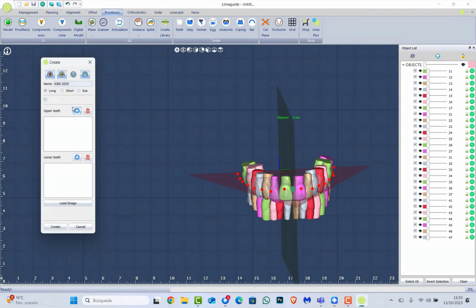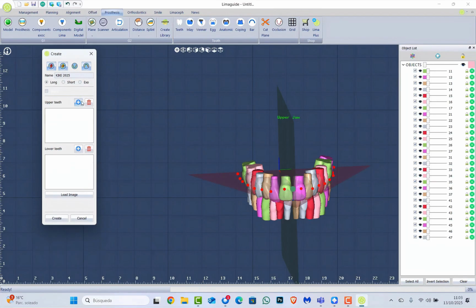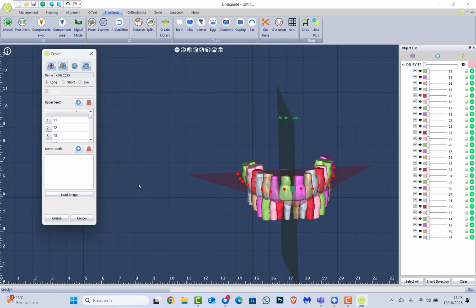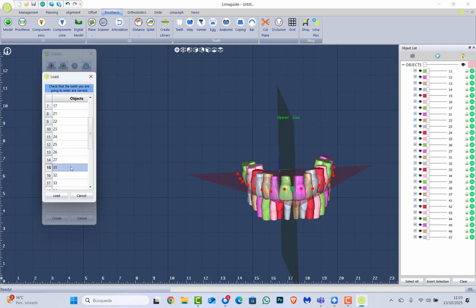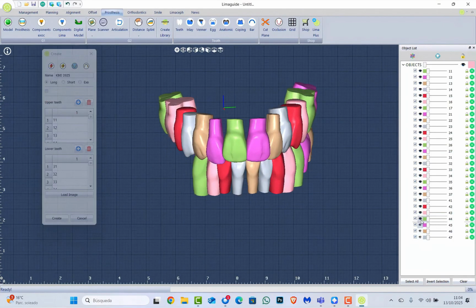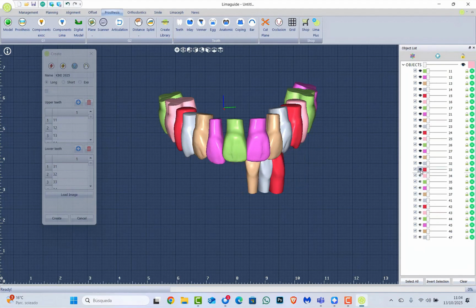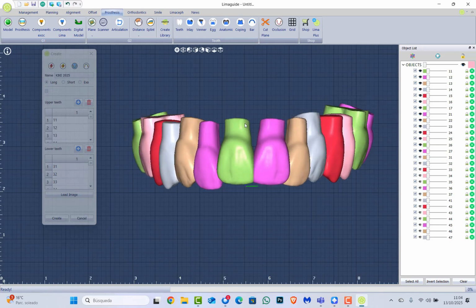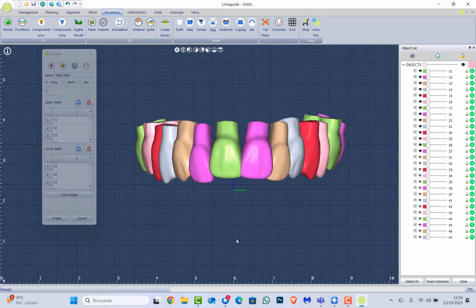So now here we need to click on the plus button and select all the upper teeth. Now I'm going to do the same with the lower teeth. So now I'm going to remove all the blueprints and also make the lower teeth invisible. And now with this here, I'm going to make a screenshot.